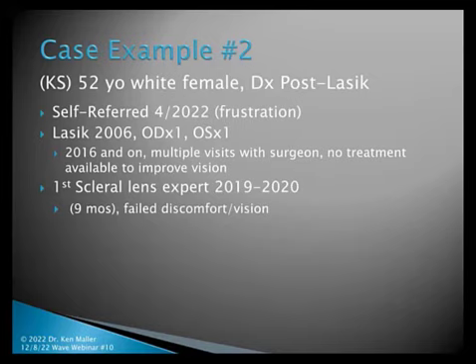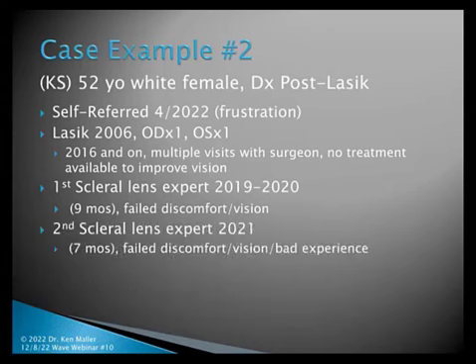doctor that I do know fits many, many scleral lenses very successfully. So this is a scleral lens expert, and she worked with this doctor for 9 months and failed due to discomfort in vision. So she wasn't able to wear the lenses and she wasn't able to see, and that was 9 months of work. Not deterred, she went to a second scleral lens expert, a doctor who I also know and who does fit many scleral lenses. In '21, fit for 7 months and still failed for discomfort in vision.